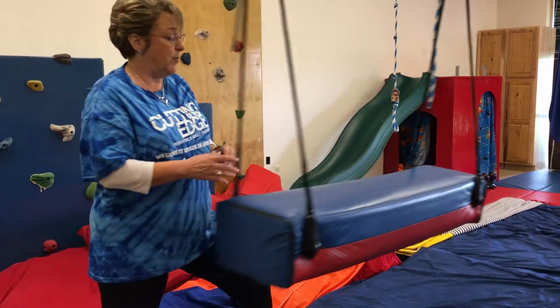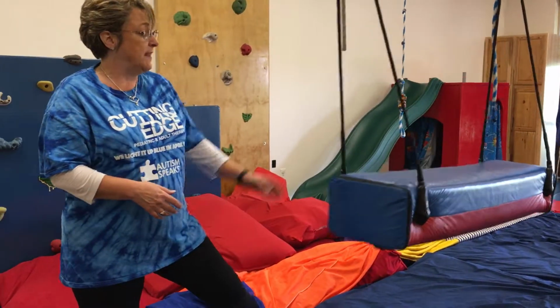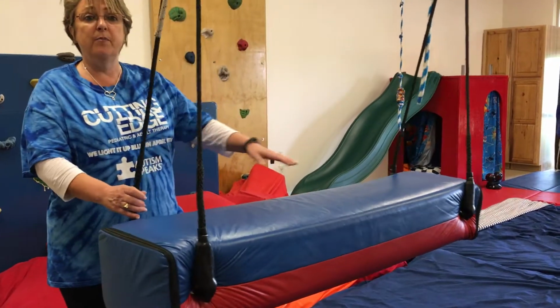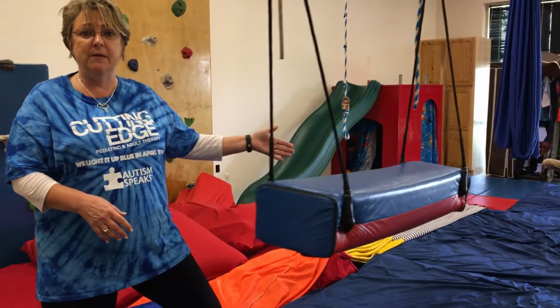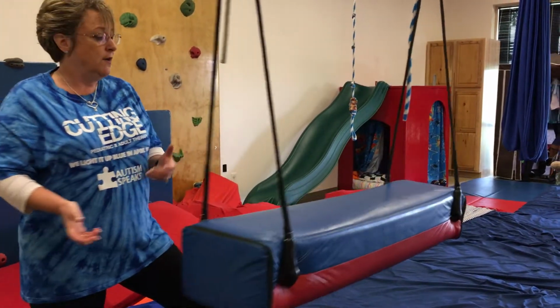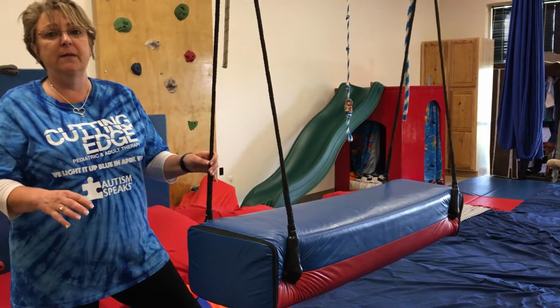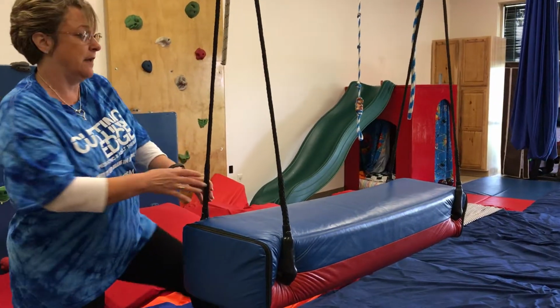But we can put somebody prone or laying on their stomach on here. We can have them sit up and pull this. We can have them stand and walk along it. But we can also use it, therapists, I see the speech therapists on here playing games where the kid will be swinging while they're playing a game and having a social activity. So again, this and any of these pieces of equipment are only limited by your lack of creativity in treatment because they do a multitude of things.